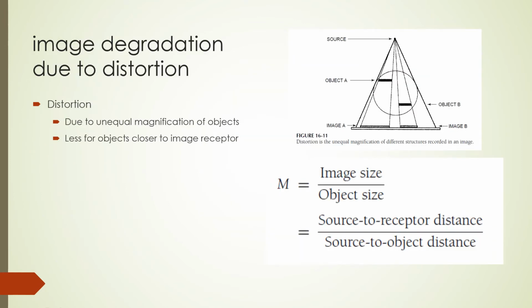Let's now look at image degradation and some of its causes. We shall first look at image degradation due to distortion. Distortion is present to some degree in every diagnostic image.